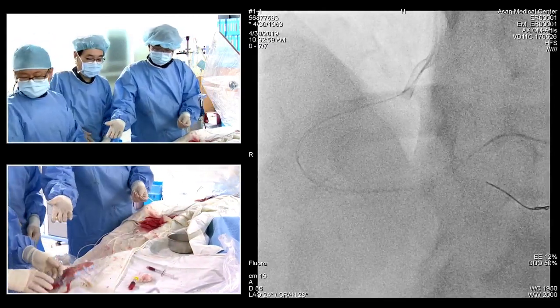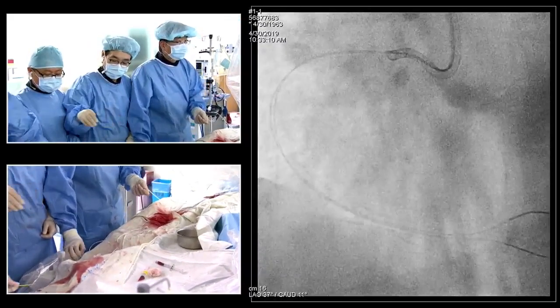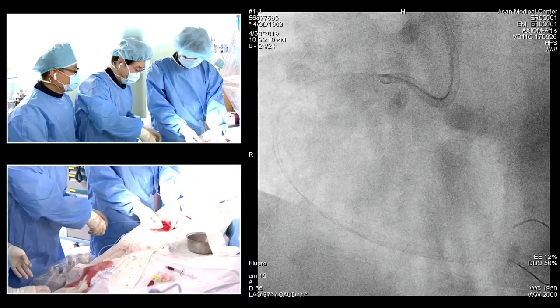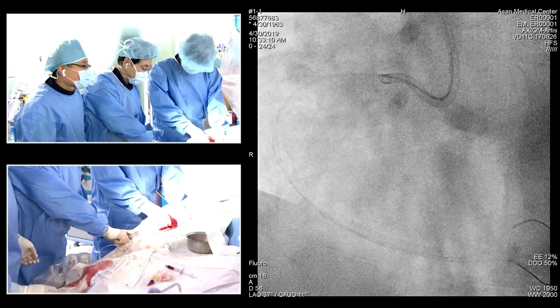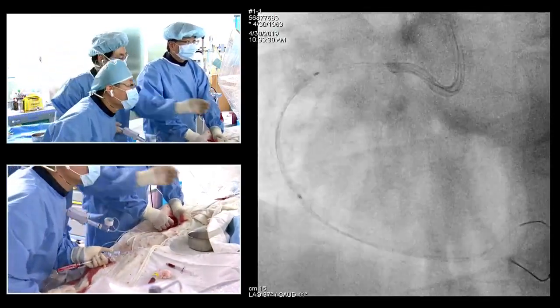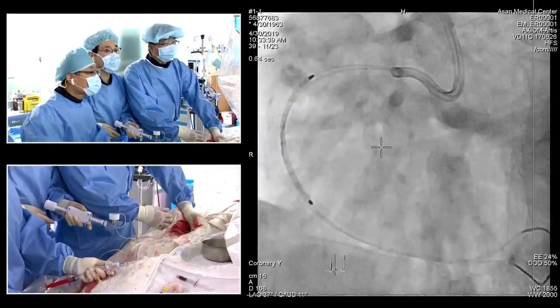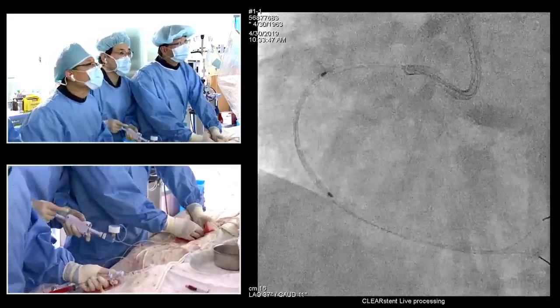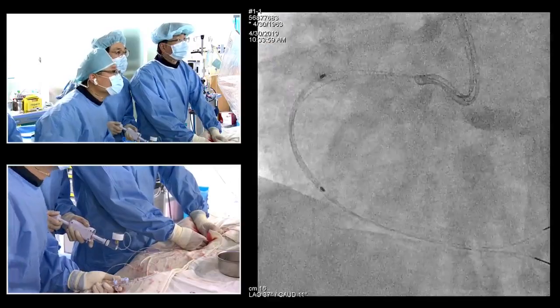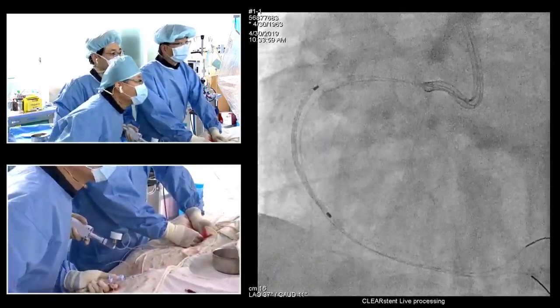Dr. Pilong, I saw the paper you published, the full metal jacket greater than 60 millimeters in the CTO. The distal luminal narrowing was an independent predictor for future events. So full clearance of the distal perfusion must be very important in every CTO. So it makes sense that the distal disease or distal perfusion status affects the proximal event. But in that paper, I did not differentiate whether it was a shrinkage or a disease segment. The distal narrowing was defined as 50% or more narrowing, starting from the distal stent edge toward the distal, for a length of more than 20 millimeters. So that was the definition in that paper. I think if you can differentiate a prominent shrinkage vessel from a disease vessel, the outcome will be different. But in that paper, that was not possible.